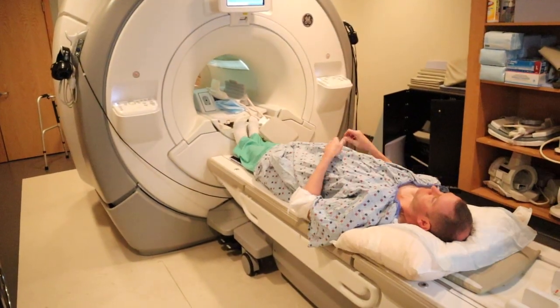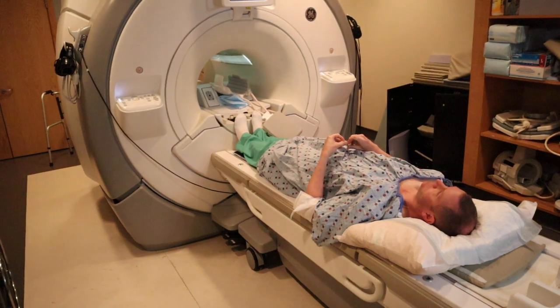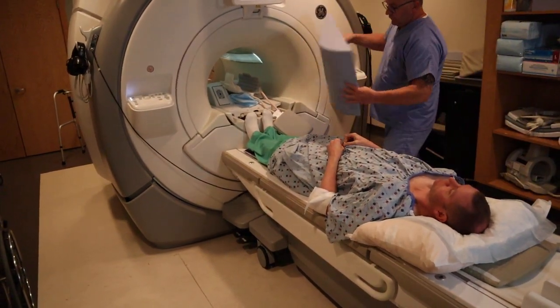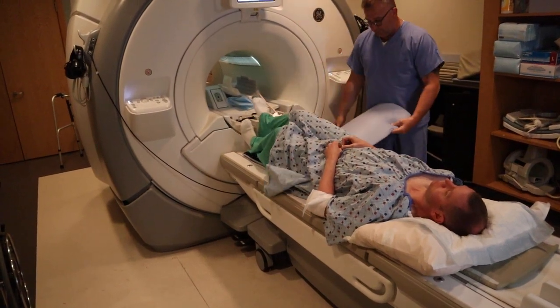For the elbow — let's say we're doing the left elbow — you want to offset the patient to the right. The reason is because you want them closer to B0.